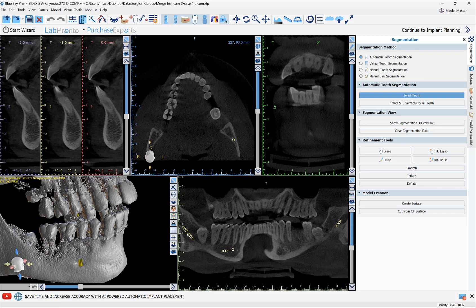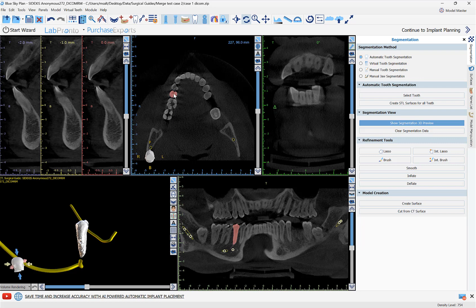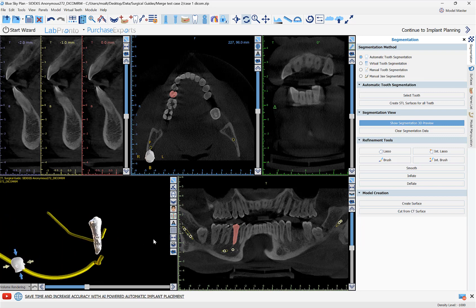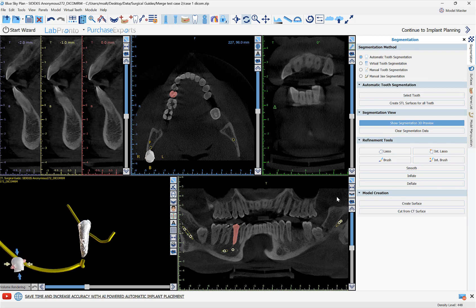In our axial view, which we can now see more clearly, we go ahead and left-click once on the relevant tooth we would like to remove from the CT scan. The software automatically identifies the tooth, and we can see that in our different 2D views as well as a preview in our 3D view.